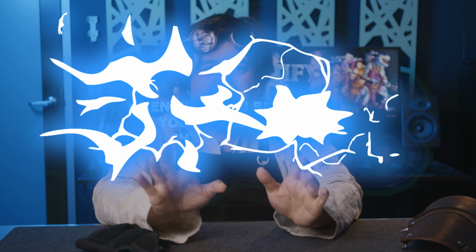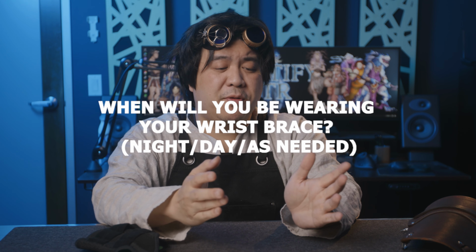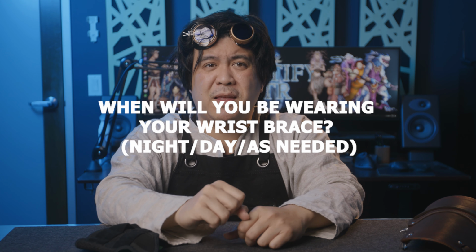Number 2, do you want to wear your wrist brace at night or during work? Or do you need something that you put on when your hand feels achy at the end of the day? This may be something that you're going to need to talk to your physiotherapist or artificer about, but usually, how long and when you need to wear the brace is based on the severity of your symptoms. If the symptoms are still minor, wearing one of these braces just at night will probably be sufficient. If, however, your symptoms are worsening, you may want to try wearing a splint during work as well.